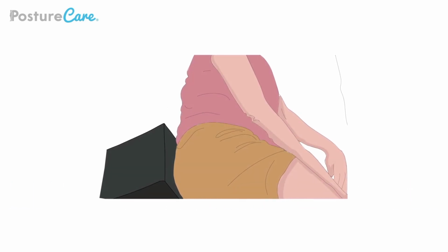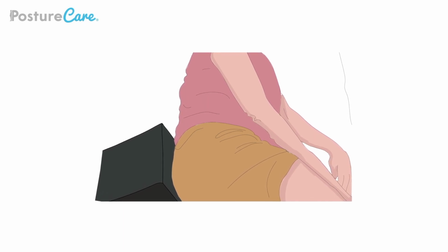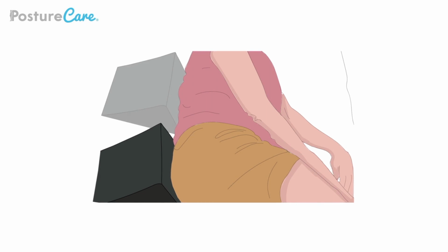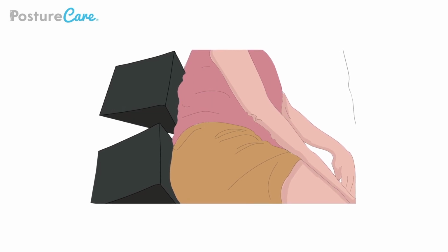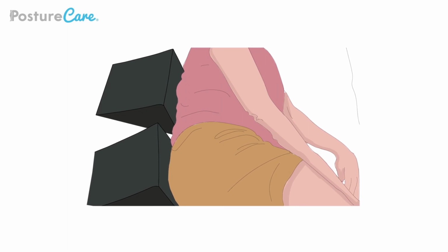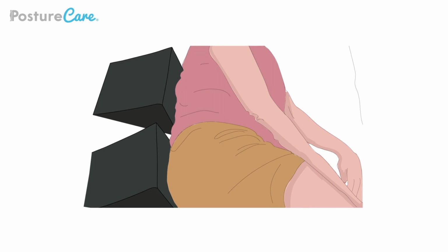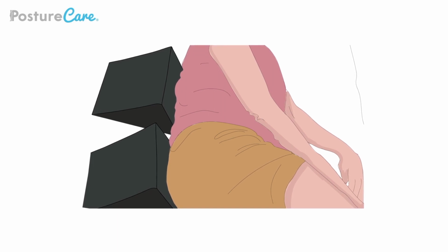With the patient on their side, place one of the double edge wedges firmly behind the patient's pelvis. Now that's in position, take the second double edge wedge and place firmly at the patient's back, in line with the other wedge. Now assist the patient to roll back onto the supports. The aim is to achieve neutral spinal alignment where possible. Please note to pull the shoulder in contact with the bed slightly forwards to relieve pressure.